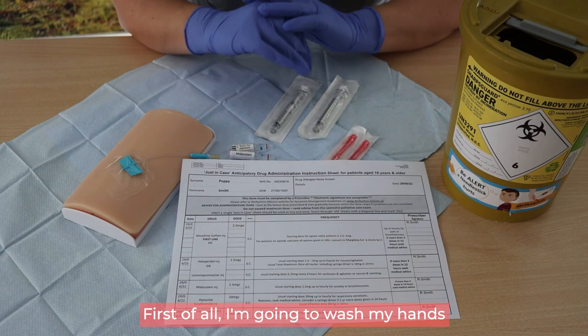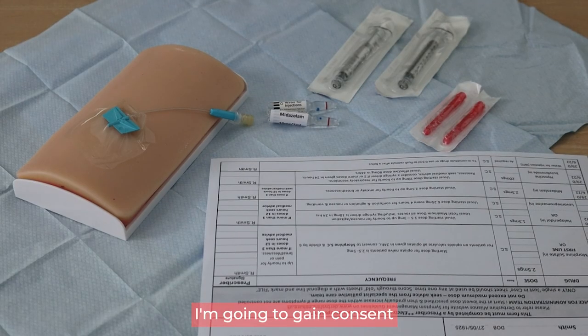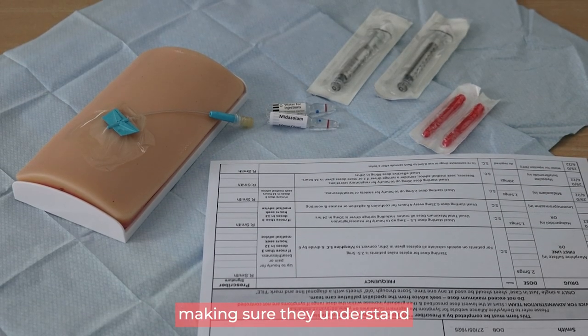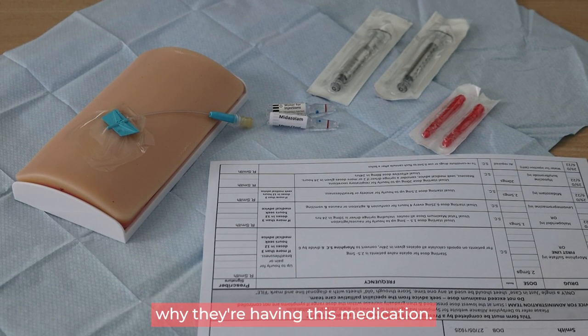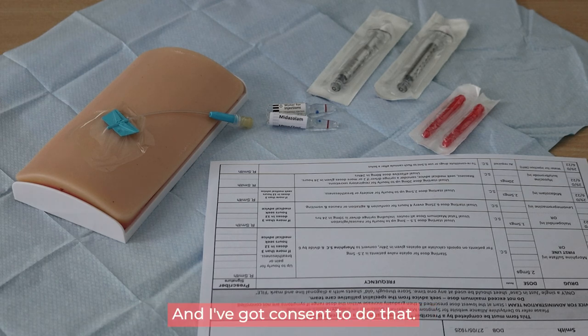First of all, I'm going to wash my hands and put my apron on. I'm going to gain consent from my resident, making sure they understand why they're having this medication and I've got consent to do that.